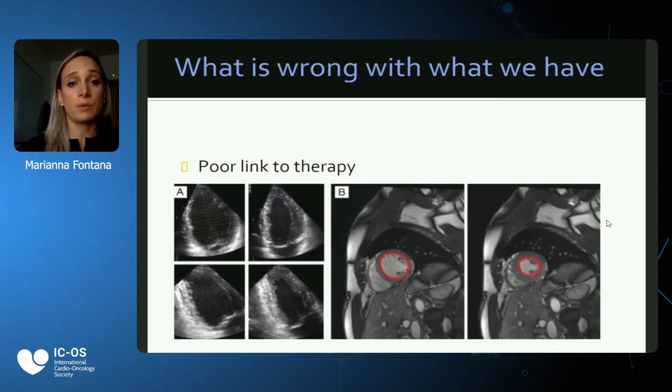When we think, for example, about ejection fraction, we all live with the fact that different imaging modalities, different machines, different operators will give us different results, different values, but we all use specific cut points to make decisions which are important for the society and also for patients, like, for example, ICD implantation.